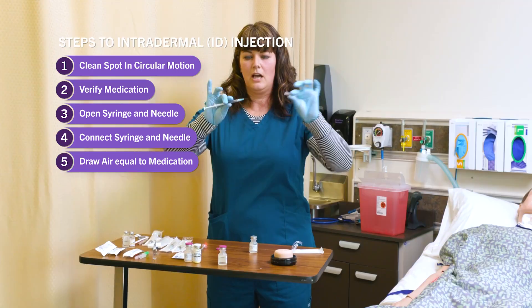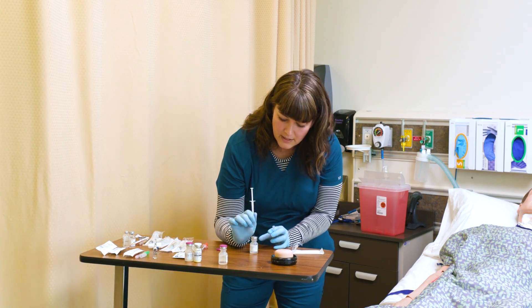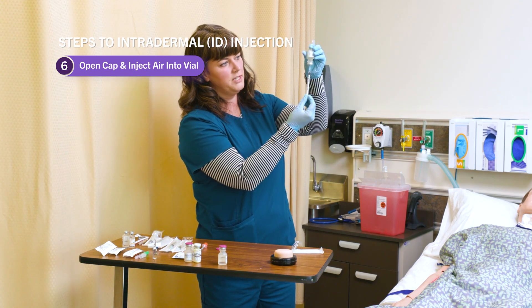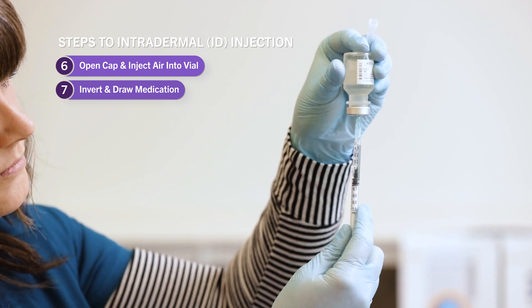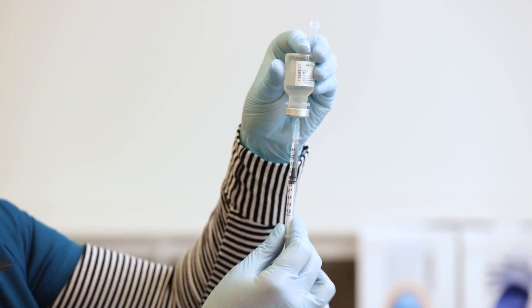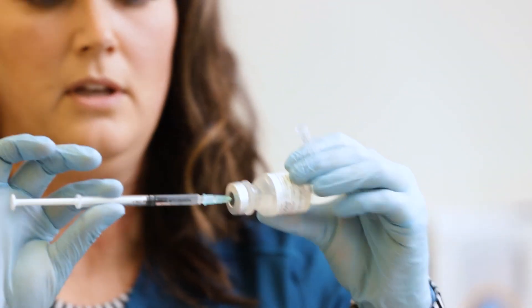Using the two-C grip, I take the cap off — always knowing where that cap is — and stab the needle into the vial and inject my air. Now I invert the vial and, being very careful, I watch the increments and very slowly draw up the fluid, overshooting slightly because I'll get some air, then push that fluid back in until I have 0.5 milliliters. The level of the fluid needs to be at the top bevel of the black mark in the syringe. Once satisfied with the quantity, I pull the needle out.